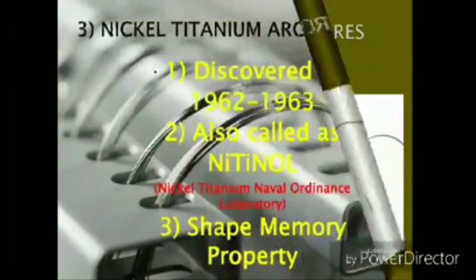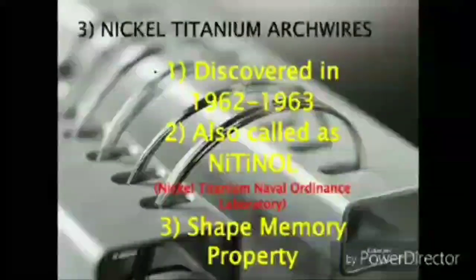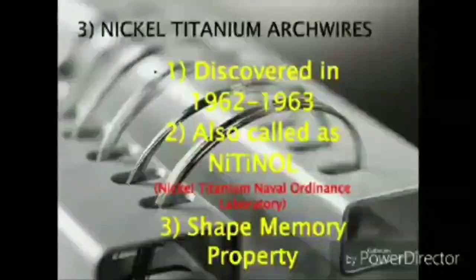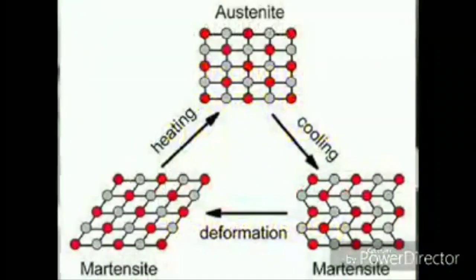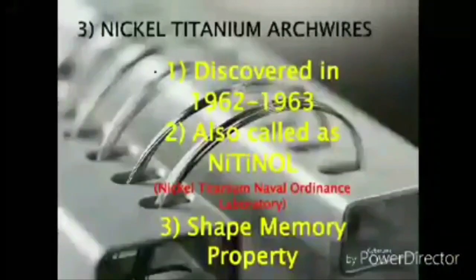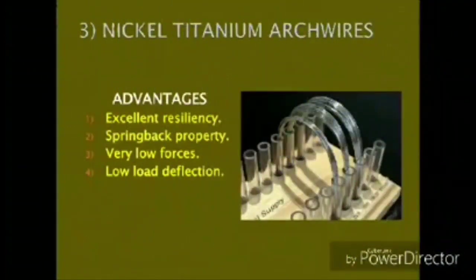Now let's talk about the nickel titanium archwires, which were developed at the Naval Ordnance Laboratory. That's why they are also called nitinol. Nitinol possesses a specialized property of shape memory effect, which means that it can revert to its original shape even after repeated deformations. Let's talk about the advantages of nitinol.